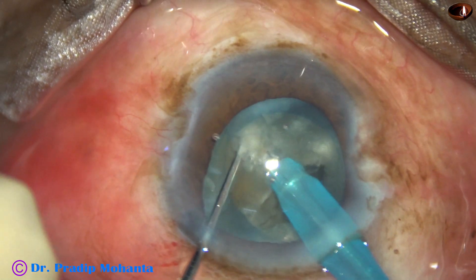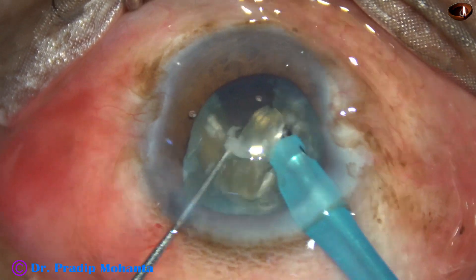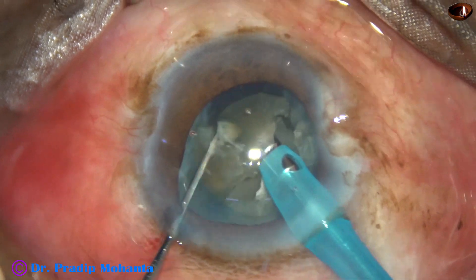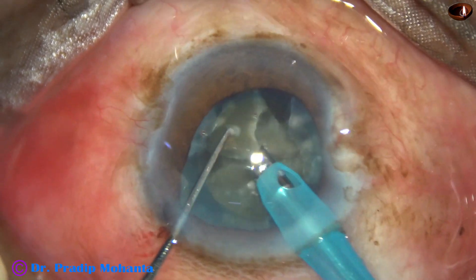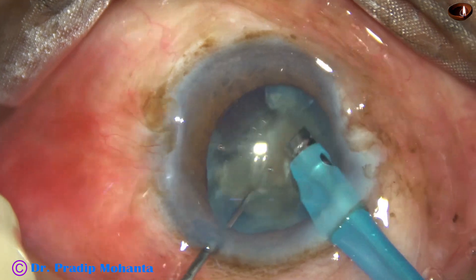The hemi-nuclei are separated completely, and now each hemi-nucleus is divided into two parts. They are subdivided into smaller parts and emulsified. The ultrasonic energy being used is 75%, flow rate is 45 ml per minute, and vacuum is 450 mmHg.